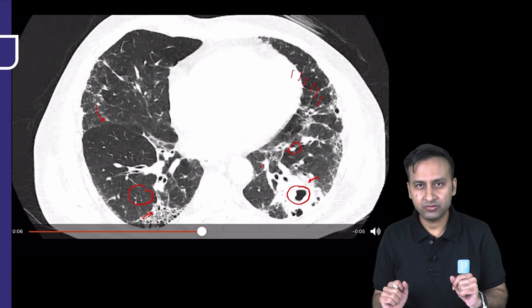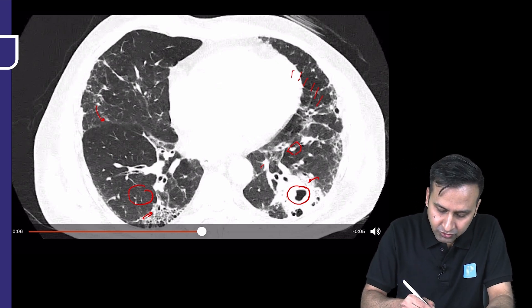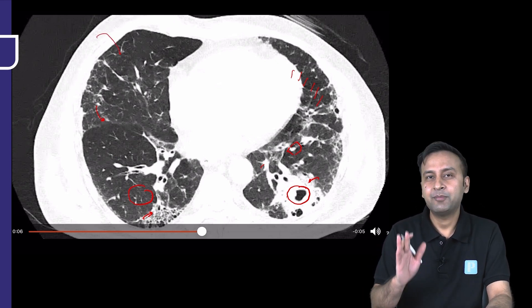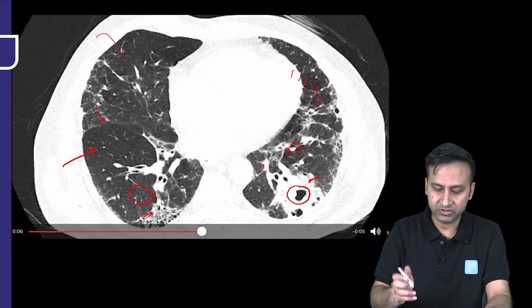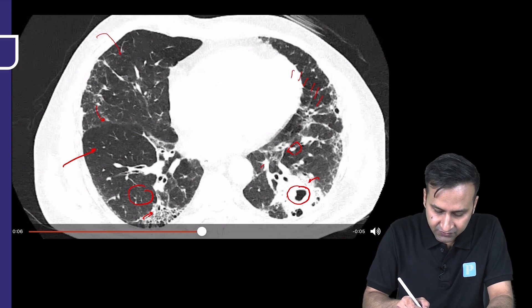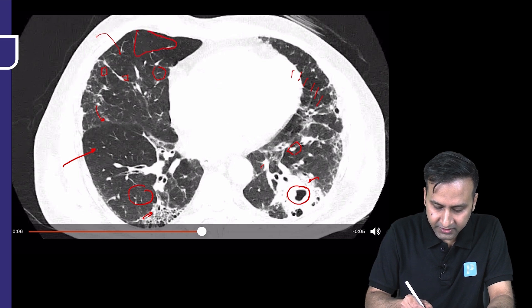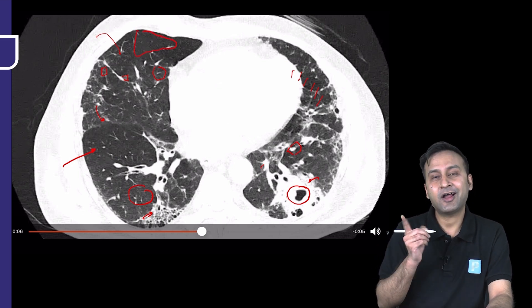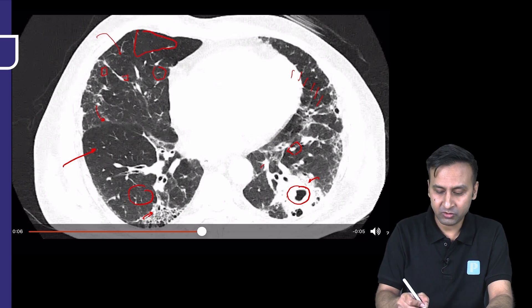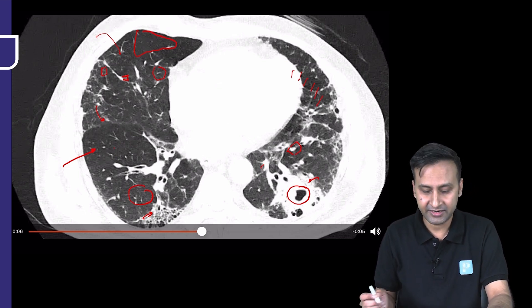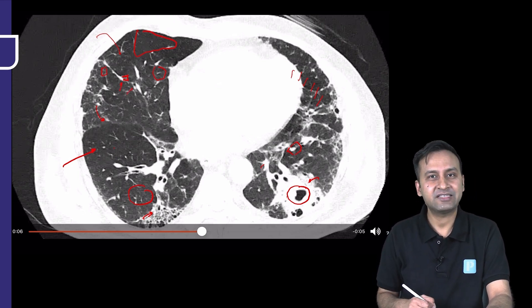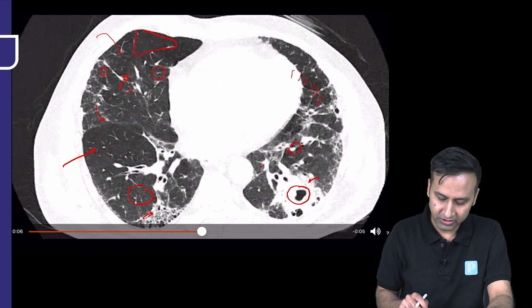We're seeing complications to the disease process as well. The lung parenchymal attenuation is not homogeneous — this lung looks completely black and lucent, while here there are areas appearing slightly hyperattenuating, and some areas appearing almost normal. We have ground glass opacities here — not focal air trapping, because the pathology is increased attenuation. Comparing with the bronchus using the dark bronchus sign, it is appearing brighter than the bronchus, confirming it is an area of ground glass opacity.